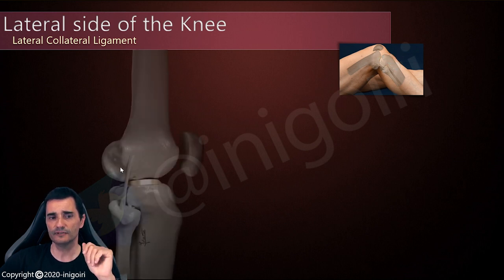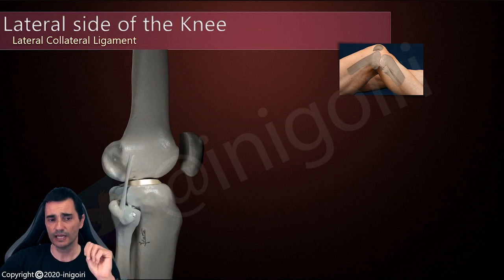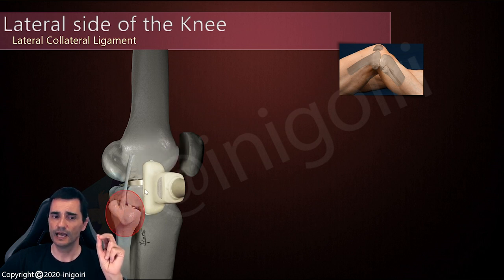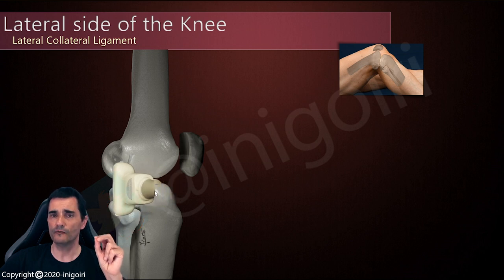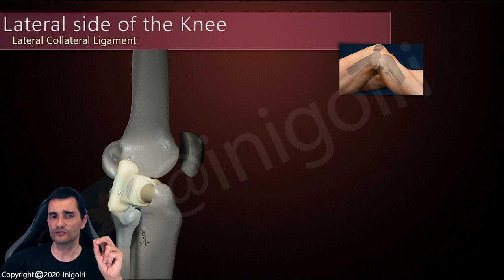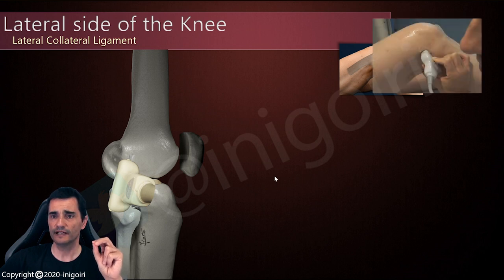To find this ligament, we will take into account the anatomy. It's not as easy as we think to find the head of the fibula. I usually recommend not to search here, but to palpate with your fingers the head of the fibula, and place the distal edge of the probe over the fibula. Once we have located the cortical of the fibula, then we know the anatomy — the ligament is slightly anterior if we are going from distal to proximal. So once we have located the fibula, we rotate slightly anterior the probe, and we will find, if we are properly located, this image.